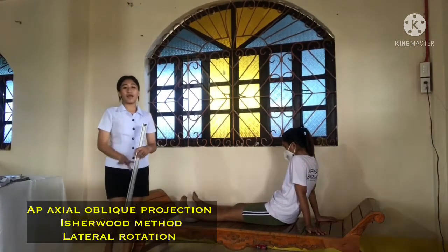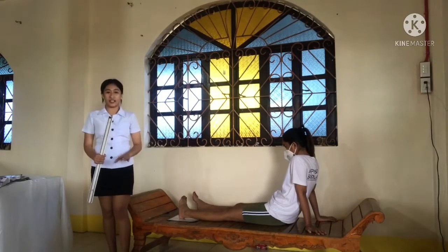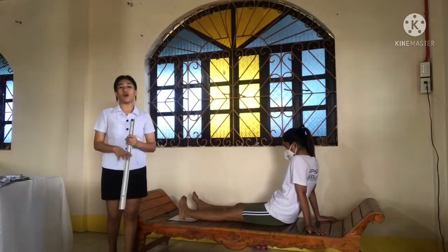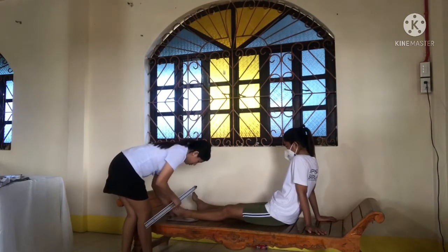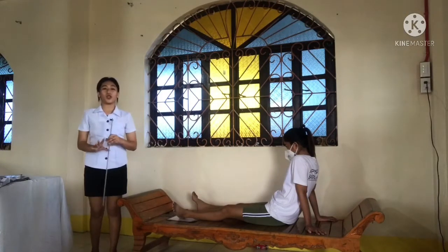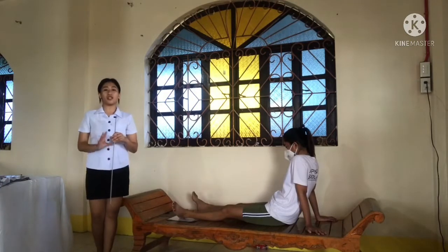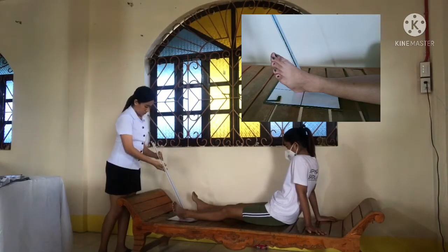So for the AP axial oblique projection, Isherwood method, lateral rotation ankle, ask the patient to rotate the leg and foot laterally until the side of the foot and the ankle rests against the optional 30-degree foam wedge. So the central ray is directed to a point 1 inch distal to the medial malleolus at an angle of 10 degrees cephalad. So this shows the posterior articulation of the subtalar joint in profile.